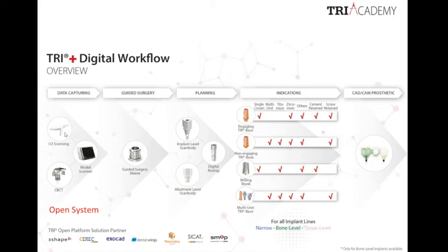As you can see on the left side, you can use an intraoral scanner, an extraoral model scanner, or a CBCT scan to virtualize the mouth situation or the model situation.